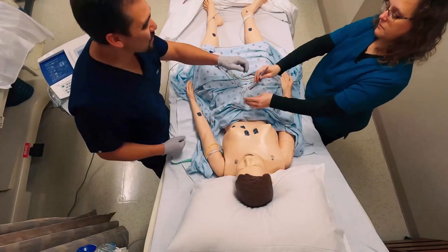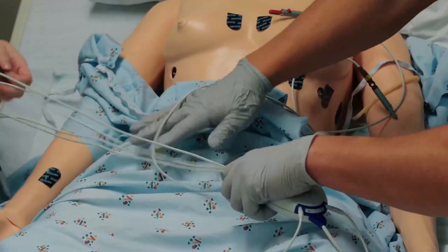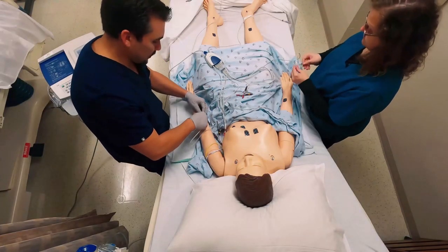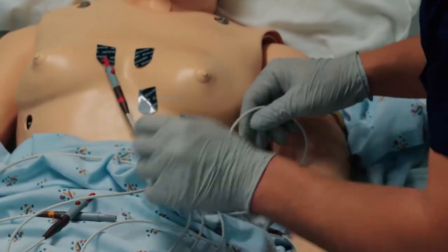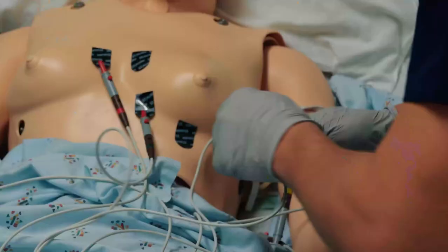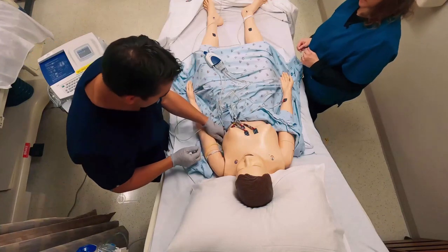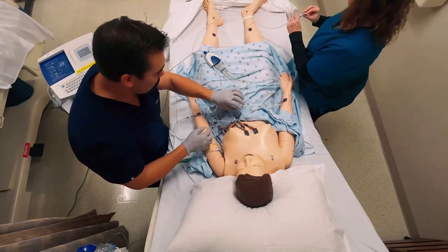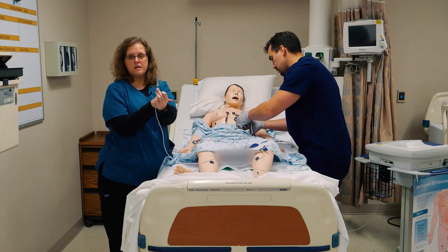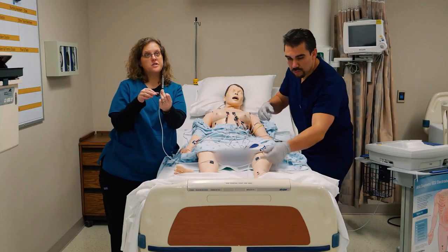LA means the patient's left arm. Here's a helpful tip: leads can get tangled like spaghetti noodles, so you'll get a really good reading if they are separated and as flat as possible — especially if the patient has tremors and it's hard to get a reading. It doesn't matter what order you connect them, as long as each lead connection goes to the correct place. Some leads are helpfully labeled, like RL for right leg, which comes in handy.